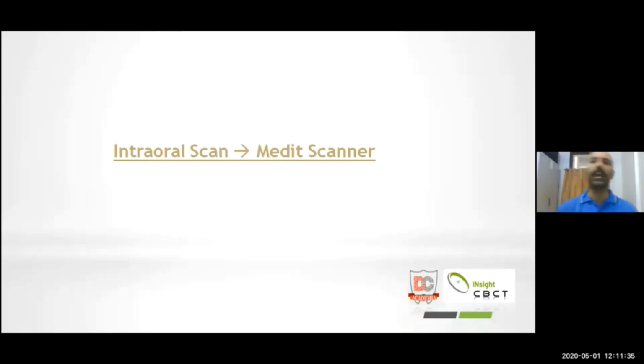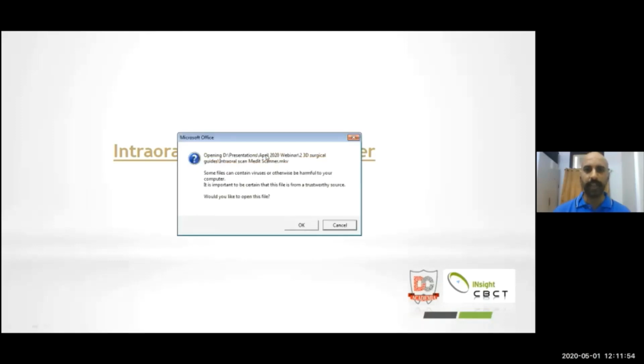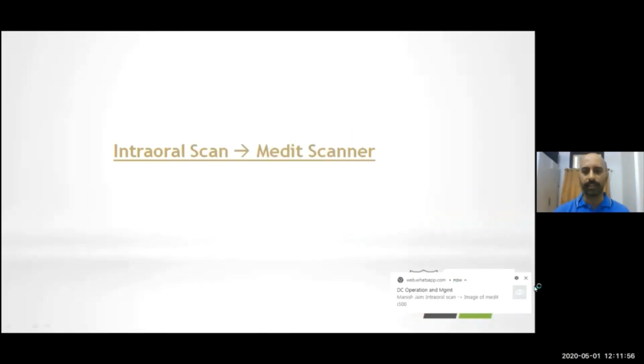In this case, we have used the MEDIT scanner, because that's the scanner that we use in our laboratory, and it is one of the leading scanners that we have from Europe. It is one of the easiest instruments that is devised. It is very quick and efficient, and I can tell you this from my personal experience. Let's have a look at it, and then you'll understand better as to what exactly I'm trying to tell you.